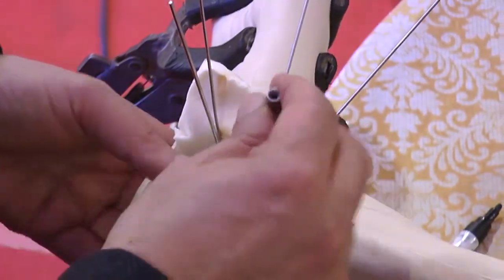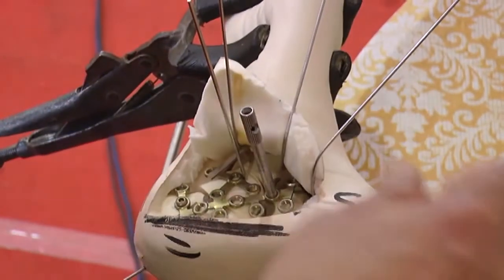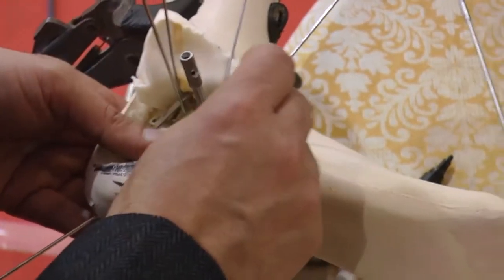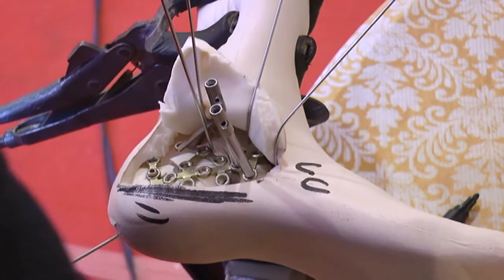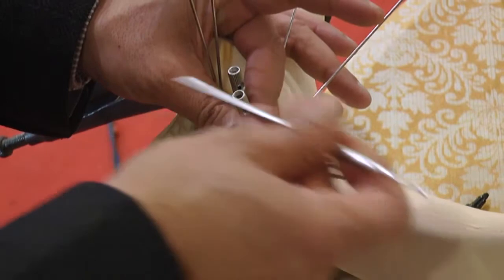Now this plate, it is possible to use one more locking sleeve. You have one more locking sleeve. So you see how malleable this plate is. It is possible to mold this plate. If parts of this plate are lifted off from the bone, you can use your locking towers.